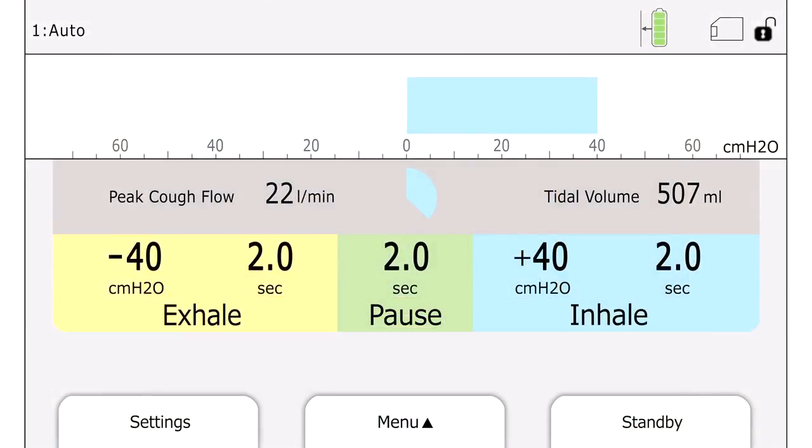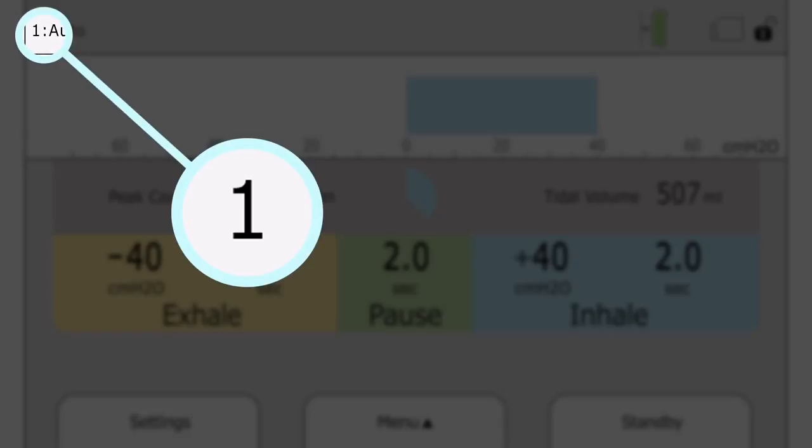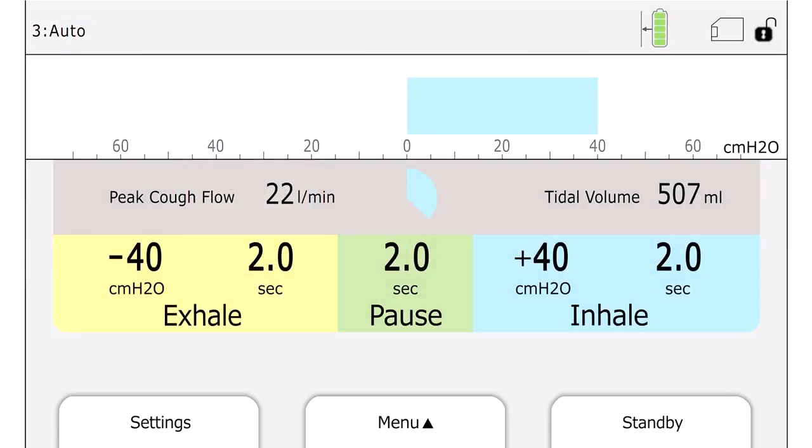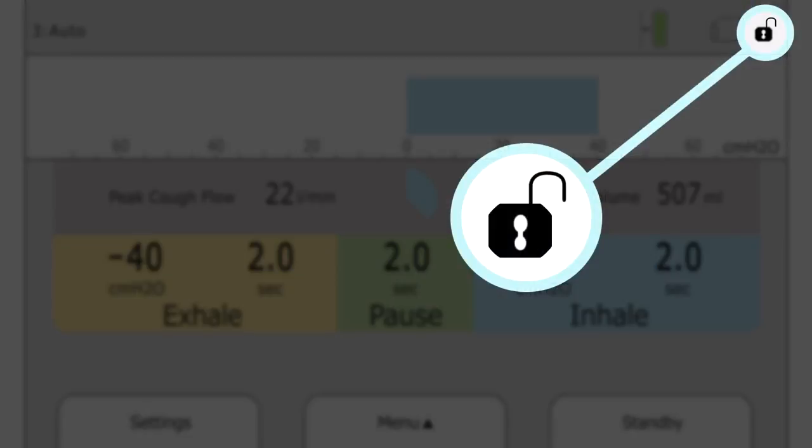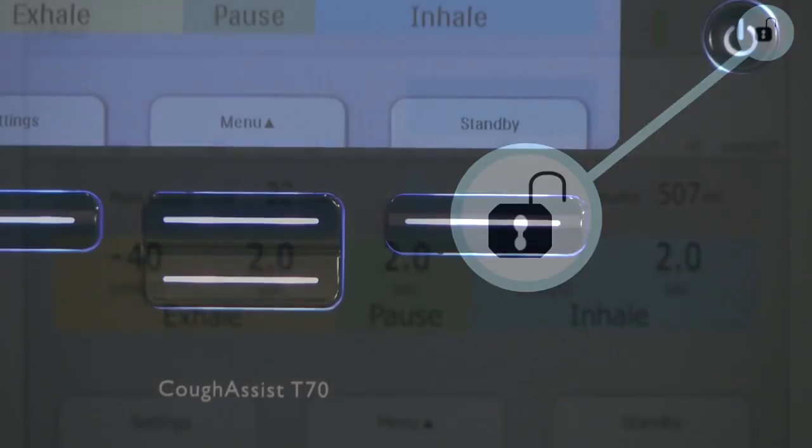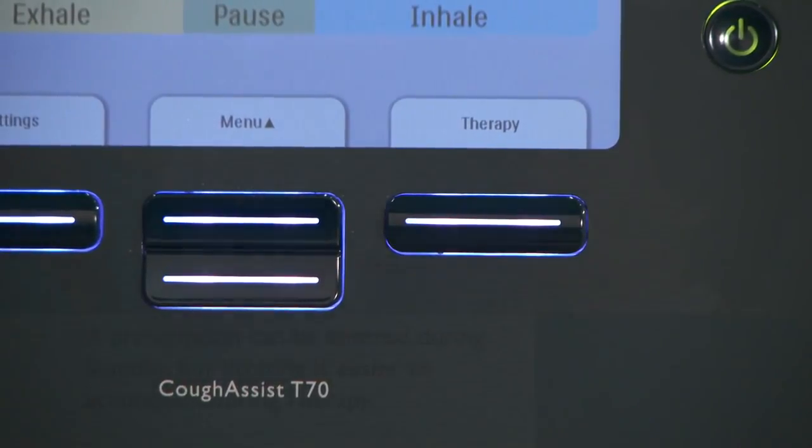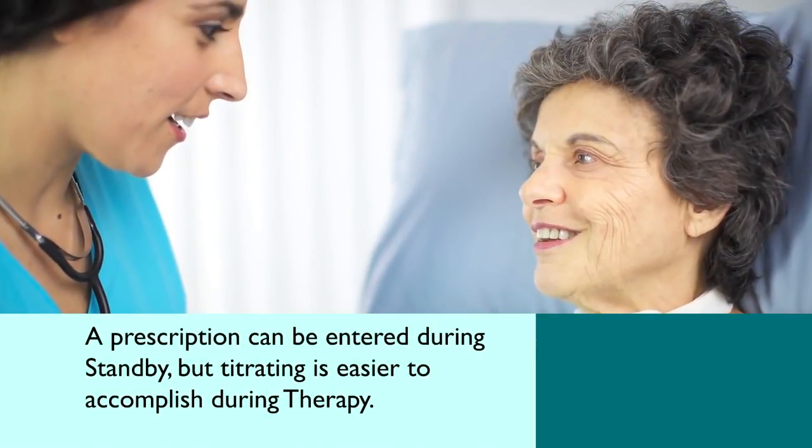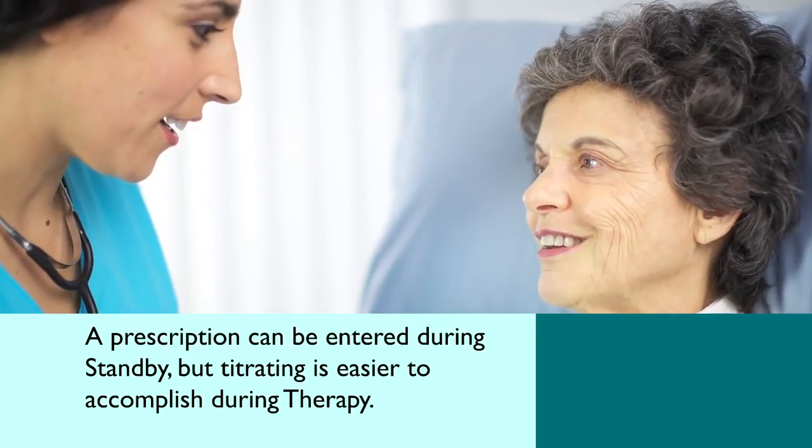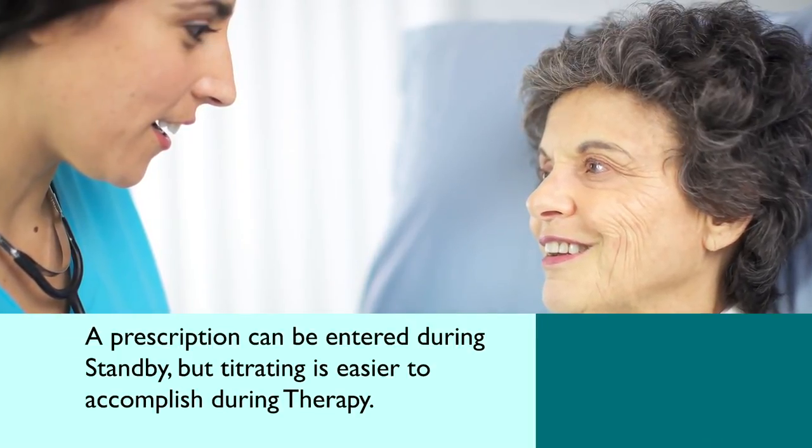Three unique prescription settings can be stored in CoughAssist T70, so you can quickly select treatment pressures based on a patient's current needs. On the upper right hand side of the screen, if you see a small open lock icon, you will be able to make changes to the settings. Changes can be made to the settings during standby or therapy. A specific prescription can be entered during standby, but titrating is easier to accomplish during therapy.